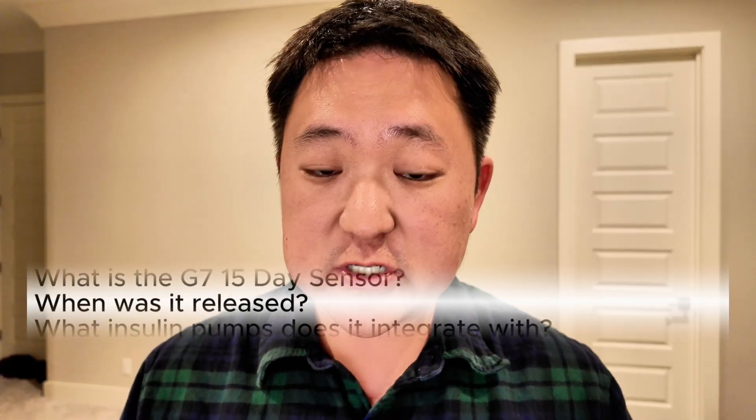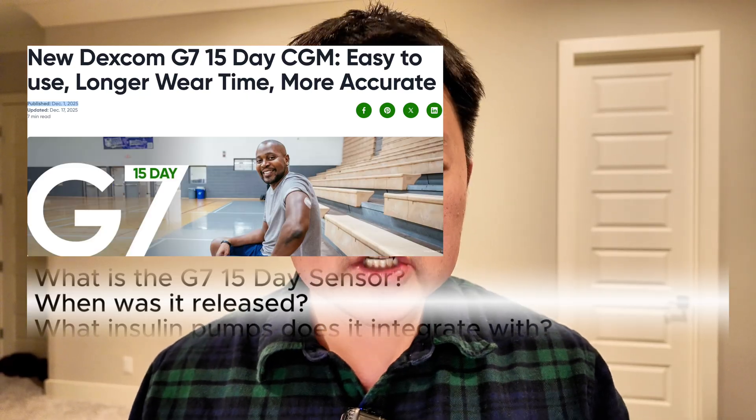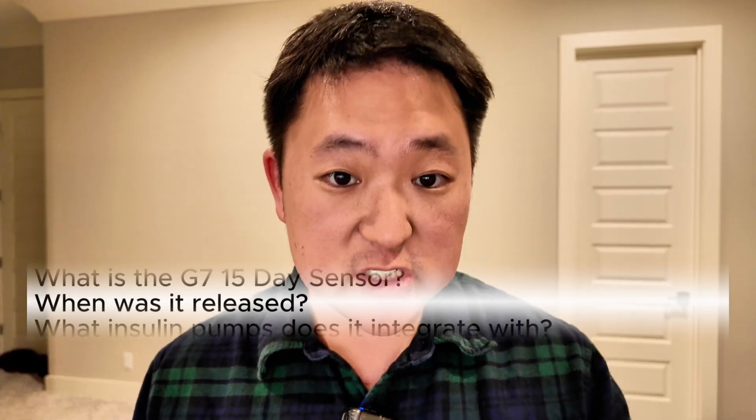The G7 15-day version first became available on December 1st, 2025, but it was initially only available through hardware channels such as Advanced Diabetes Supply, Byram, or Edgepark. It just now became available through pharmacies in the first part of January 2026.